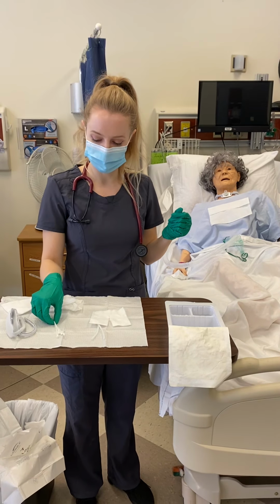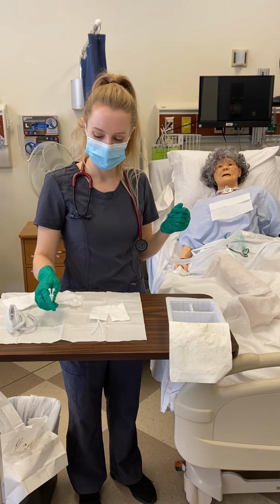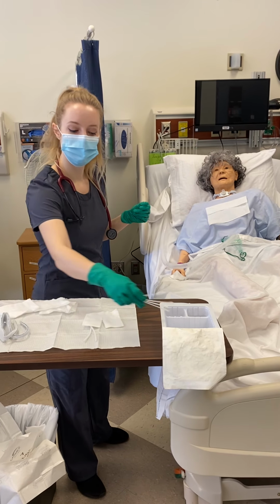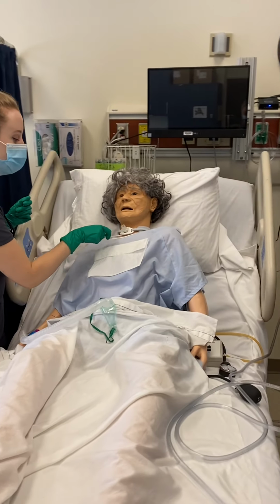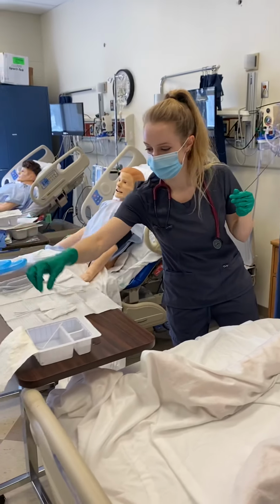With my dominant hand, I'm taking swabs in normal saline. And I am cleaning thoroughly around the trach site before discarding.